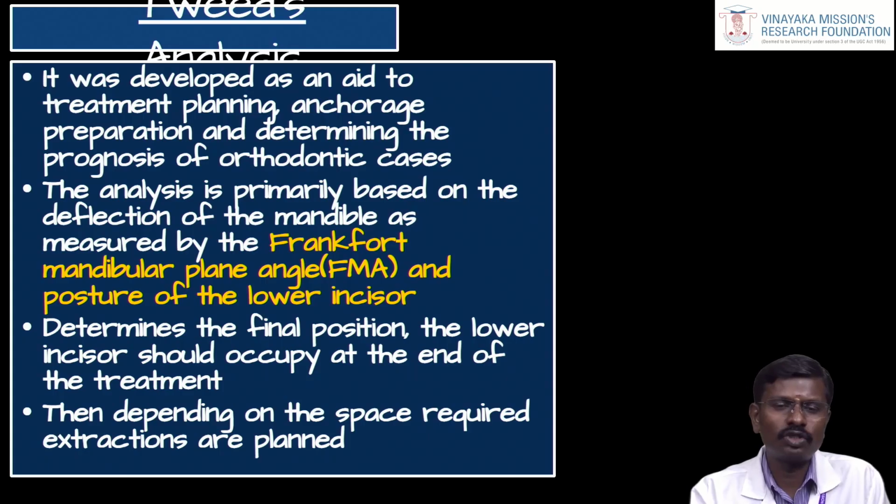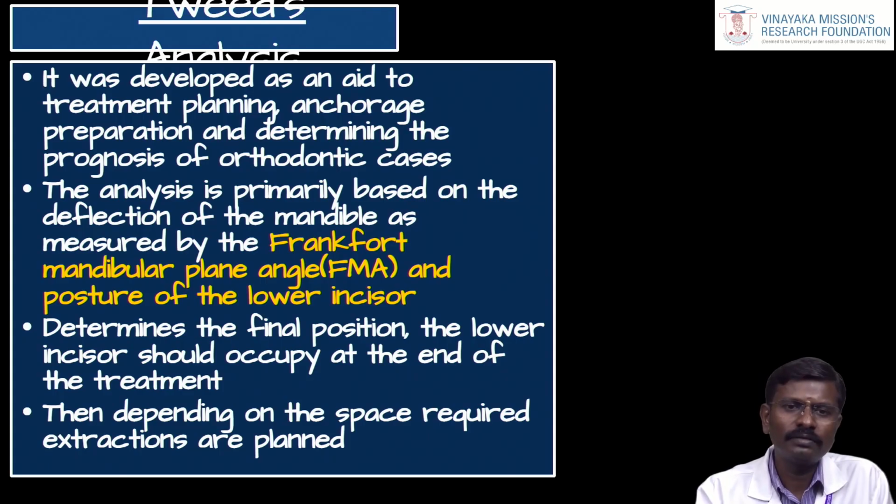This was designed by Tweed. According to Tweed, the lower anterior might be the reason for most of the malocclusions, or the position of the lower anterior will decide the prognosis of the treatment or the longevity of the treatment.